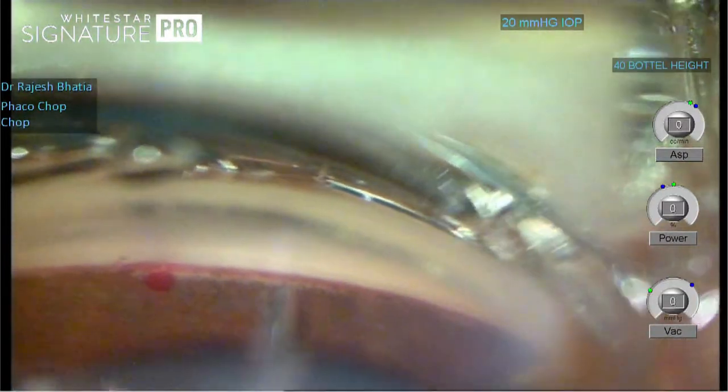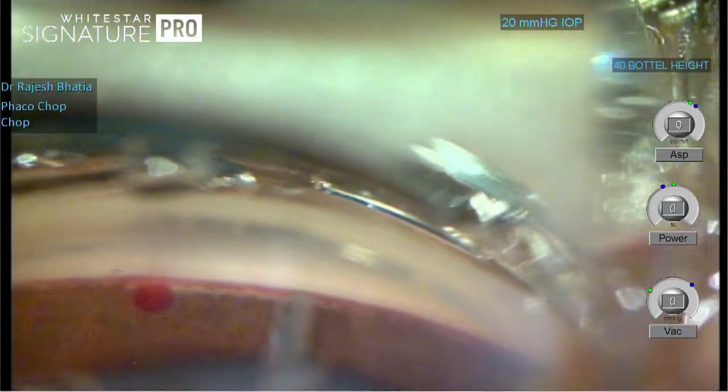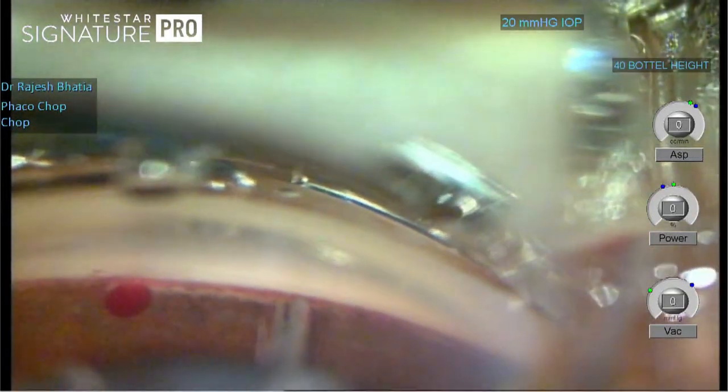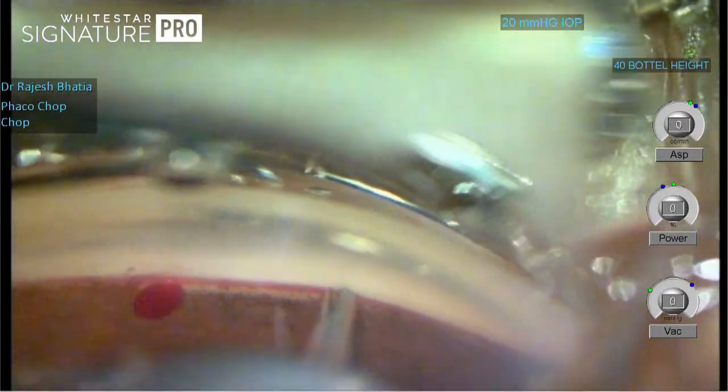Little more. Okay. So you can see where it started bleeding is the place where I've injected my first iStent. Now that red line is the place where she's going to inject. She's going to put two stents. She's already put one from where that red spot is coming. And now she's going to just insert the second. Go ahead, Sahebaan.